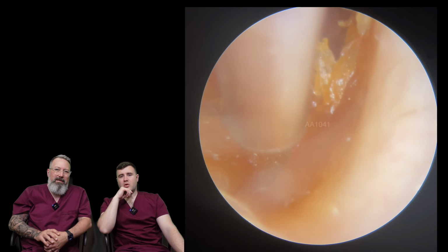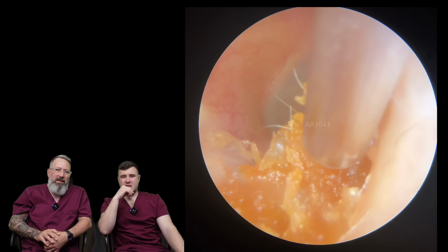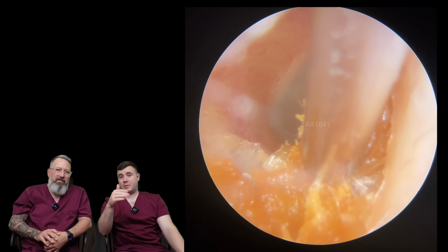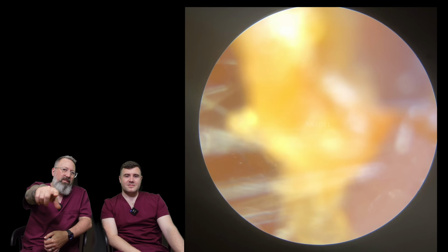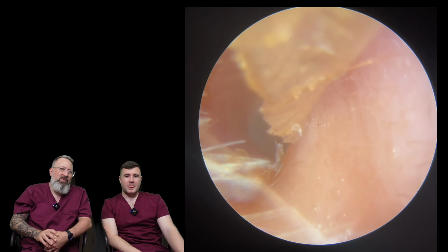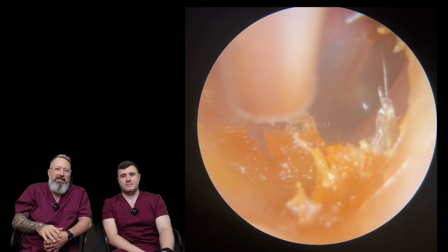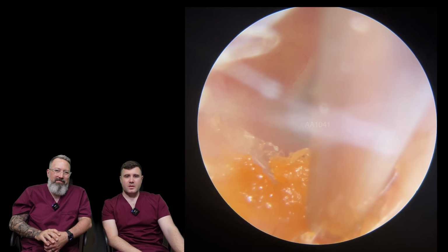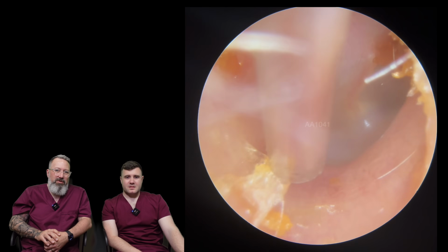Probably could have put a little bit more oil in at this point just to try and... I mean, it is coming away okay, but usually would have come away a little bit easier. You can see it's still... imagine if all of that had come away as one, because I think that probably would have if it was just the right circumstances. Nice. Oh, that was a good piece. Yeah, there we are.